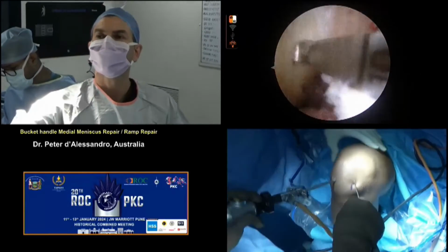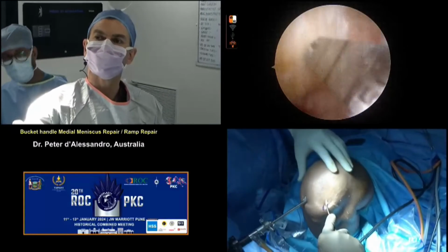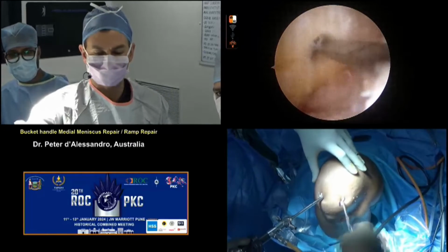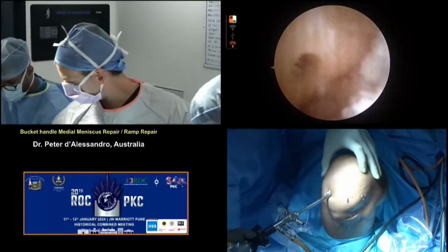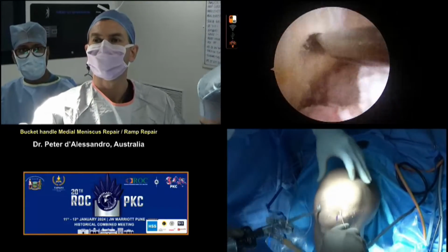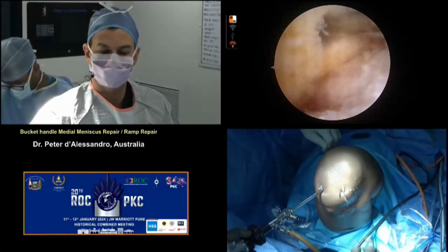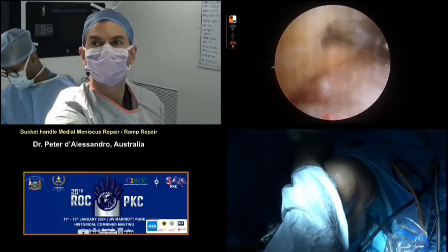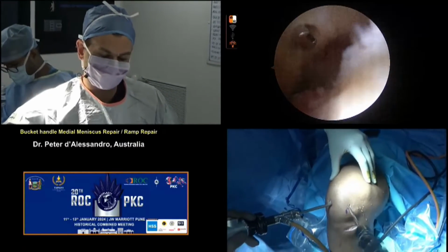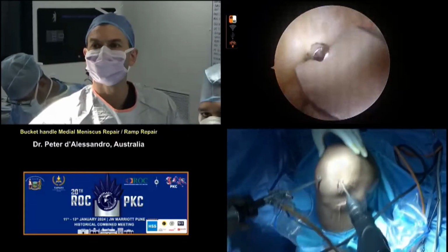Flex for me. So we're just measuring our femoral tunnel. As always, it's 40 something, 48, 46, 44, 43. Perfect. That guide wire on hand again, thanks. There it is, beautiful. And flex up, guys. So we've got a 7 centimetre graft. So I'm going to aim for about a 25 socket, as we said, docking inside the knee. Here, flex for me, please.